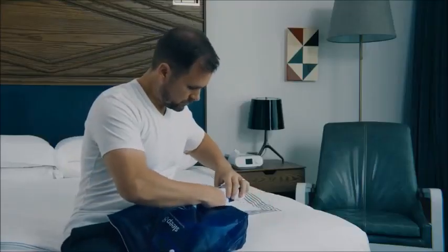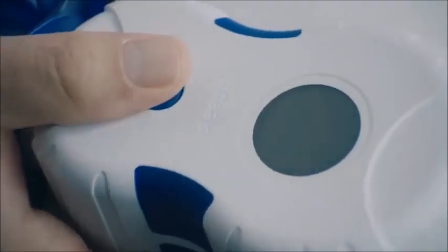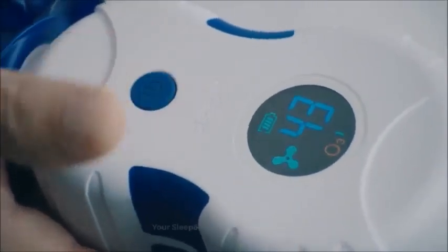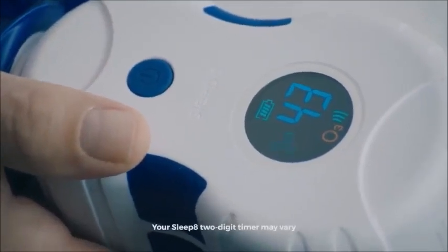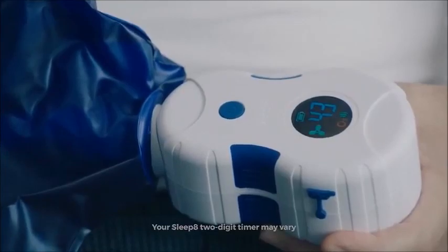Now is the easiest step. Finally, find the small round power button. Press it until you hear a beep and see the Sleep8 screen light up. That's all. Your Sleep8 is now doing its sanitizing magic.